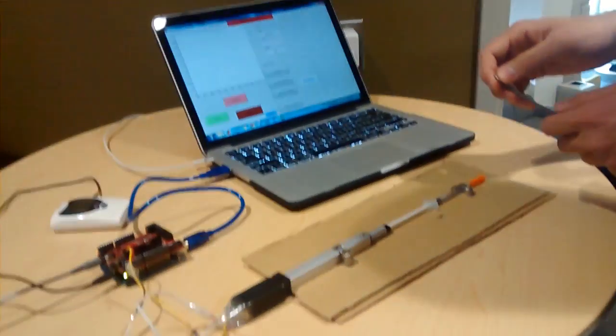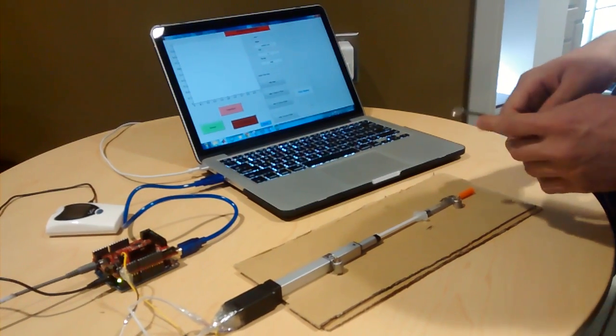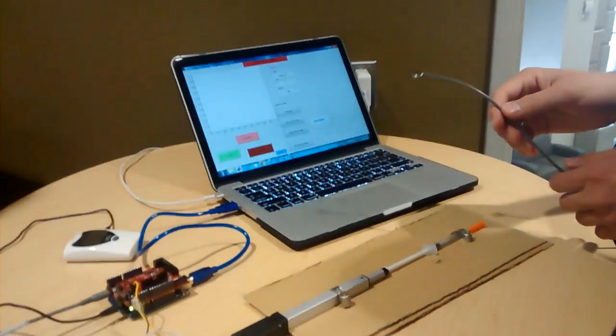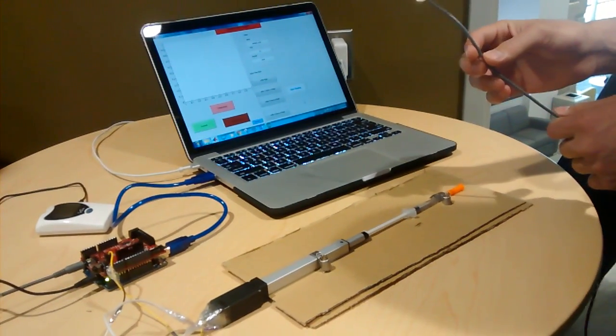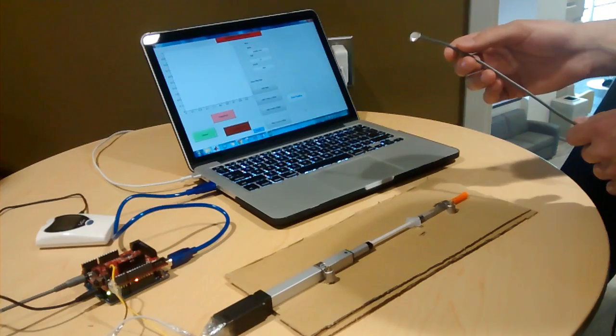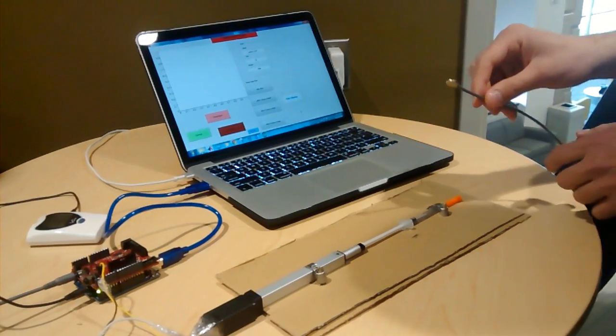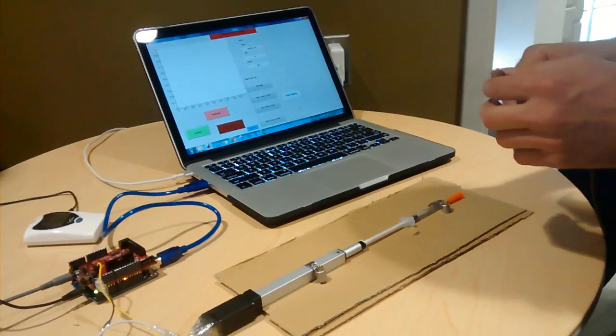Today I'd like to share the demonstration for our project with you, medical alert system. Simply, we have the measurement of temperature and glucose meter. Our first scenario is to get the patient temperature, and once it goes up to a dangerous level, send a trigger and send email.